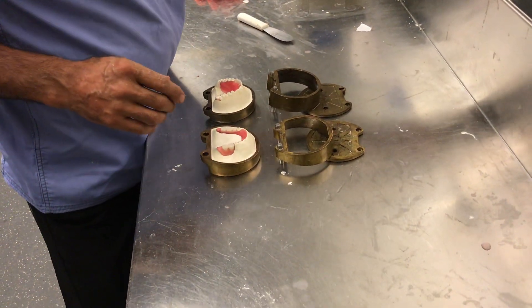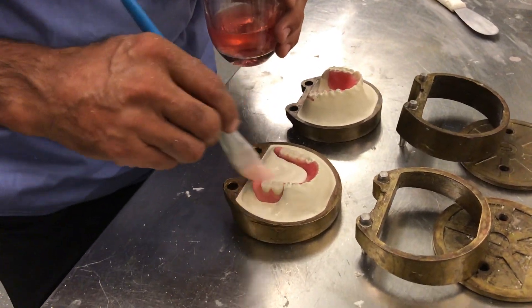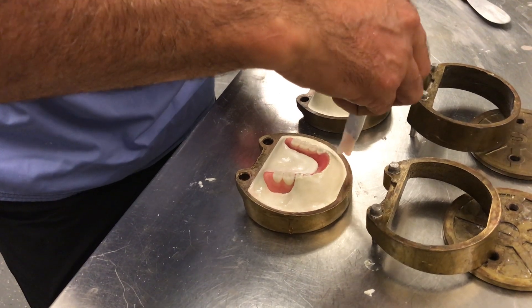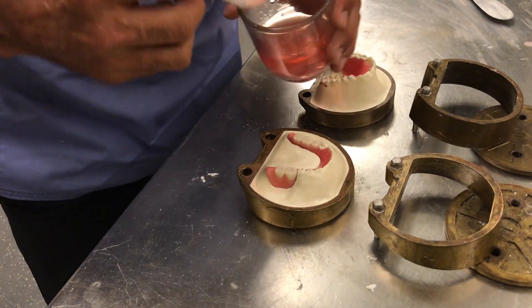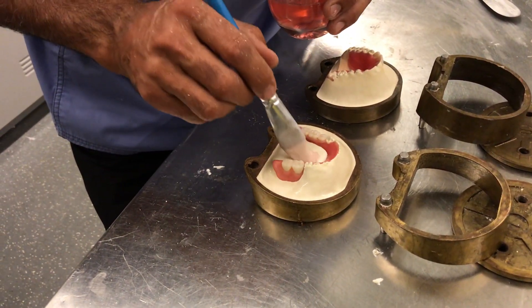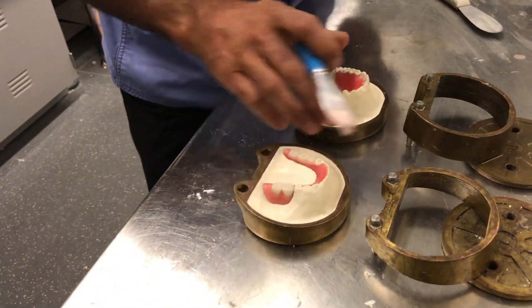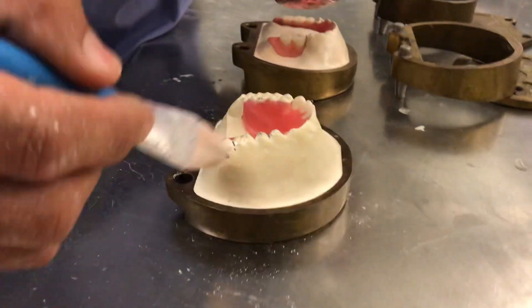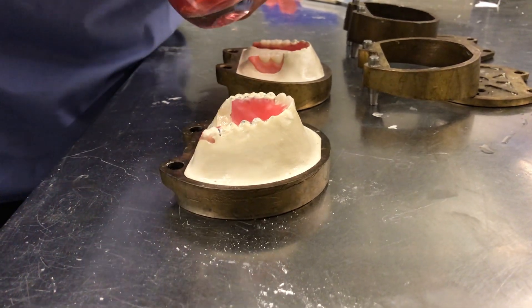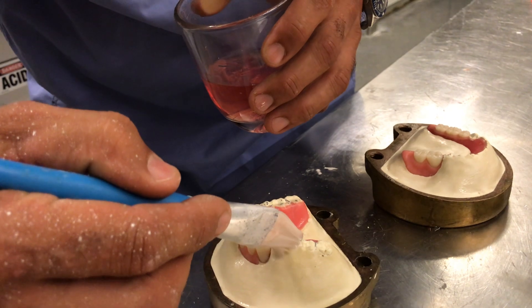Continuing with the second half of the investment, we want to make sure that you apply separator once more. Just a thin, generous film of separator. Avoid applying separator within the wax up. This works very well when you have a very soft bristle brush. Moving on to the other side — get it as close as you can to the wax up.